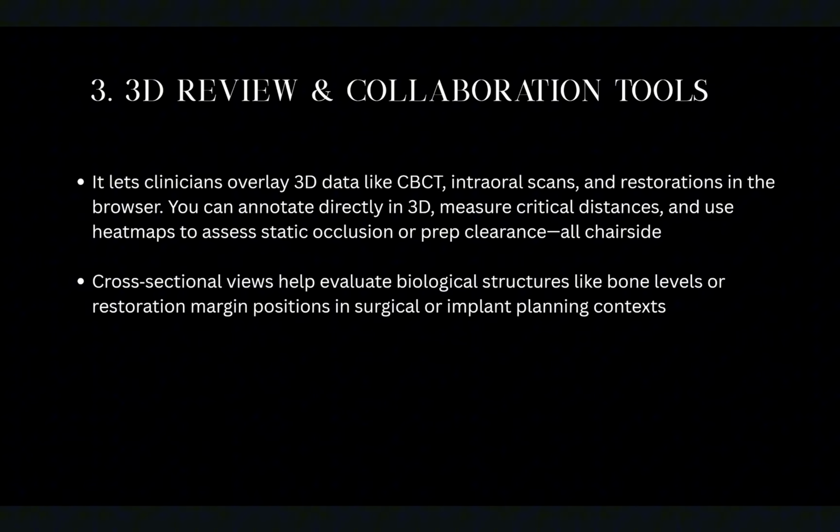The cross-sectional views also help you to evaluate biological structures like bone levels or restoration margins in position, particularly when you're looking at surgical implant planning contexts. This, yes, is something that you could do on other softwares, but it's simple, it's easy, everything's already all loaded. You just have to select what you want to build into the stack.